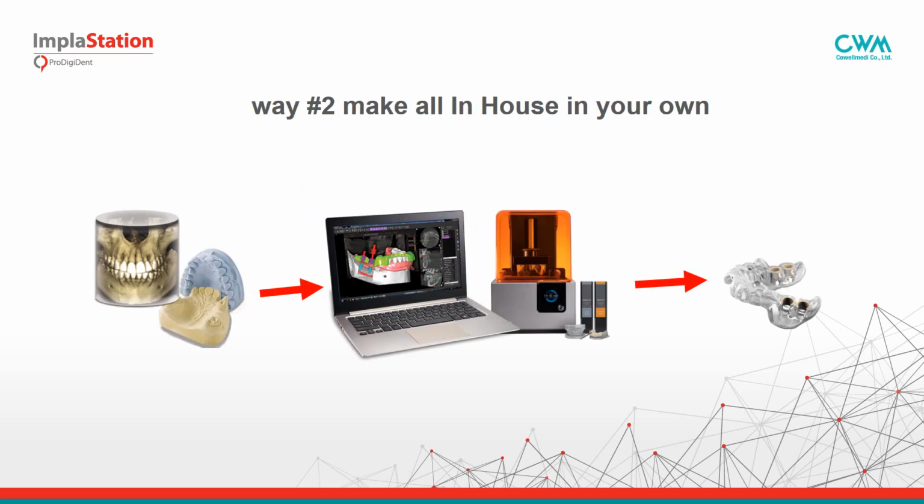Second way, to do all steps by yourself in-house in your clinic. Of course, for this you will need to have the software, to have some experience with it. You have to have a 3D printer.